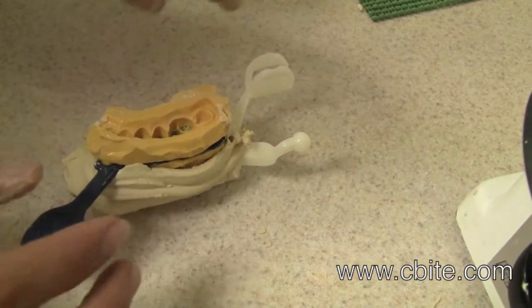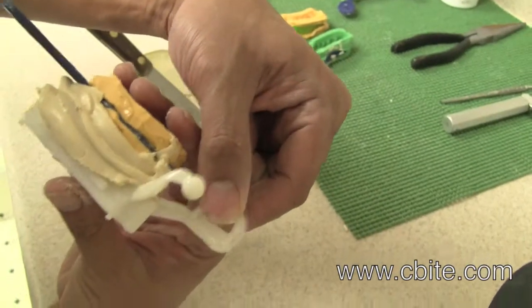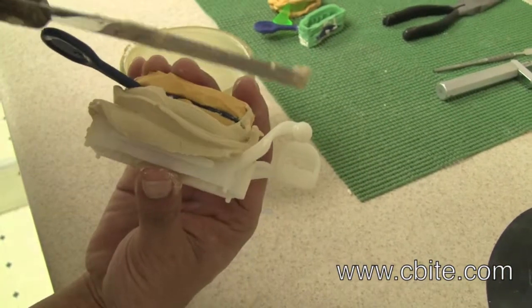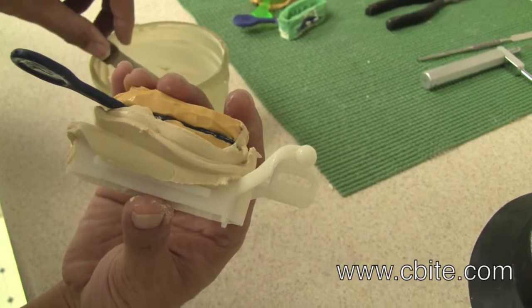At this point, make sure it's aligned properly and also that it's level. Make sure the center of the impression is level with the ball.